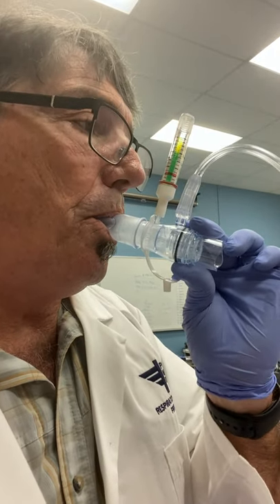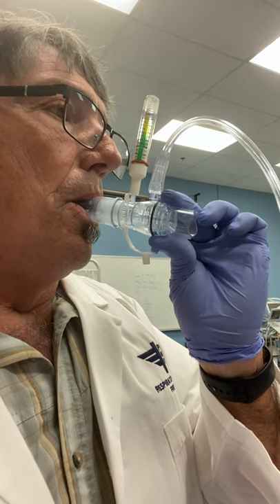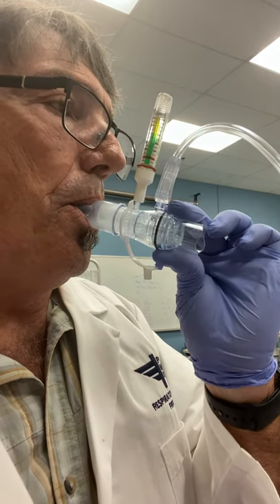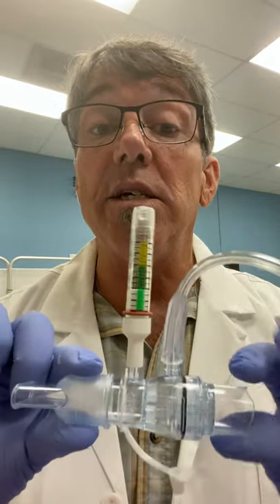I'll go ahead and demonstrate how this might look as you're giving a patient the EZ-PAP treatment. We want to have the patient breathe normally, not too fast — normal rate is preferred. They're going to feel that resistance and push against it and just have a nice breath in and blow out. Not hyperventilating, just a normal pattern. If you notice the effort meter, I kept it in the green. By having set about five liters, that seemed to maximize and kept me in the green zone where I'm maximizing the benefit of the EZ-PAP.